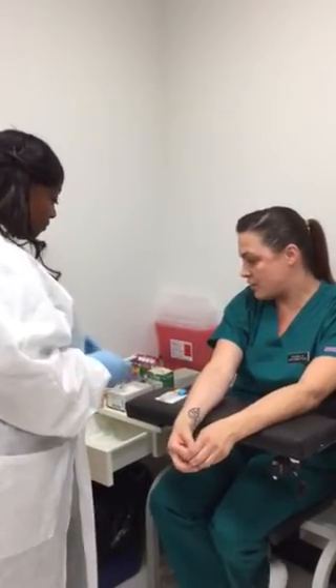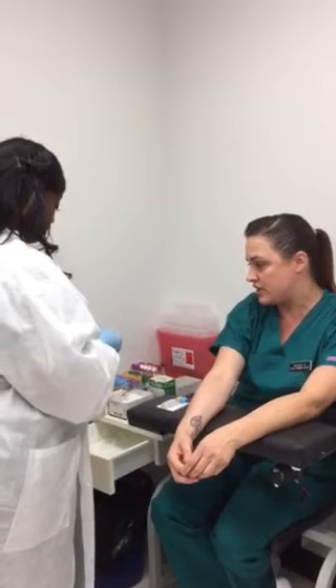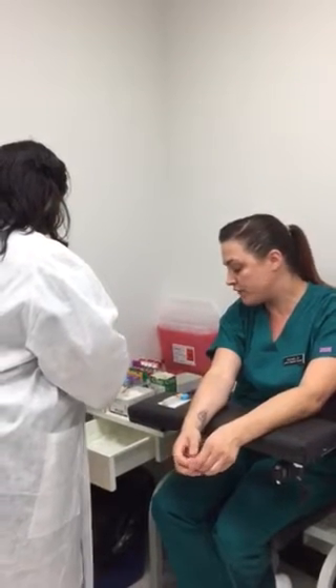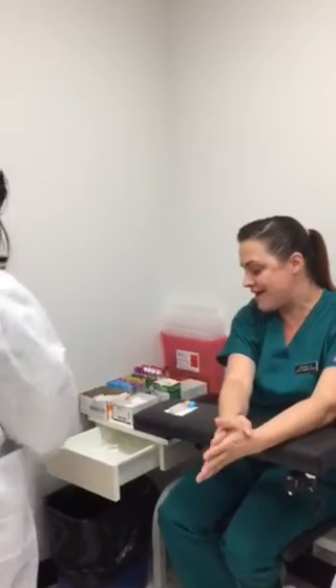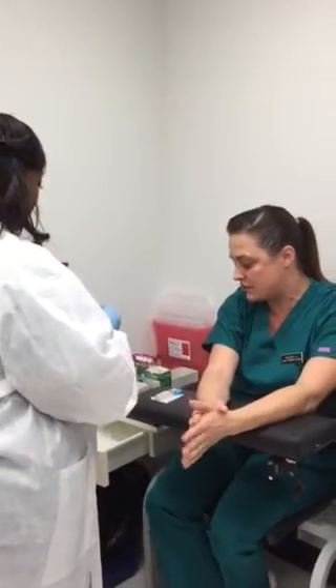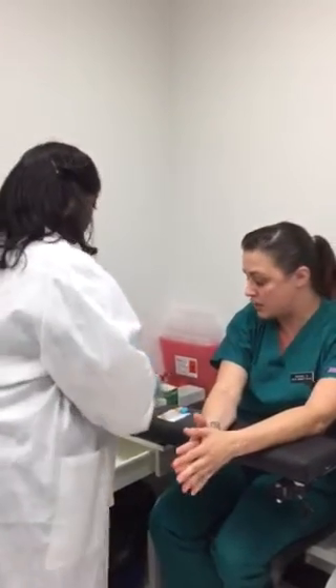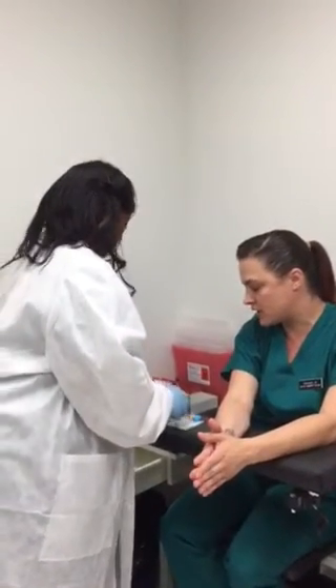At this time she's setting up her station. She's going to get her needle, she's going to get her hub. She's pulling for an ALT, an AST, and a PT. So at that point she's going to pull a light blue that's going to go to coag, and a gold that's going to go to chemistry.